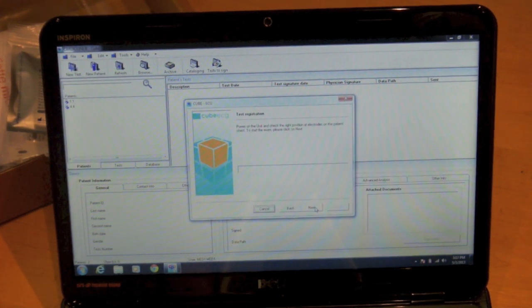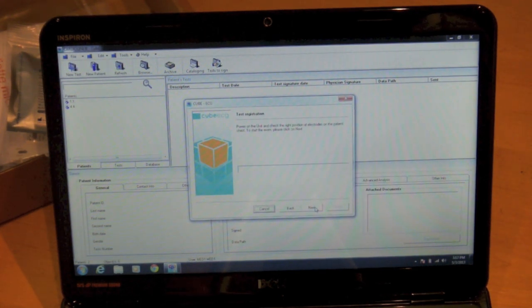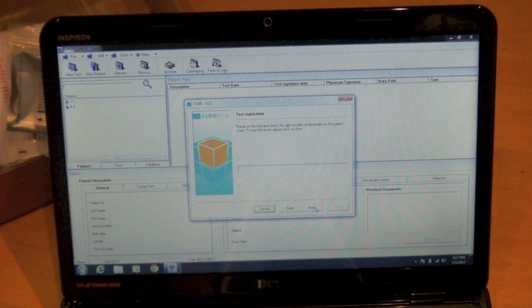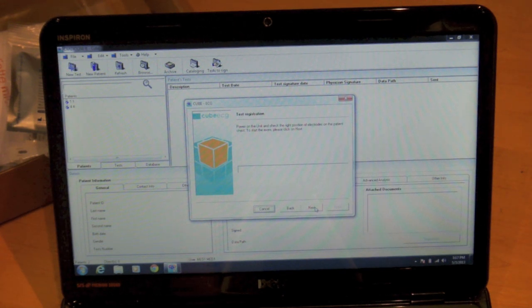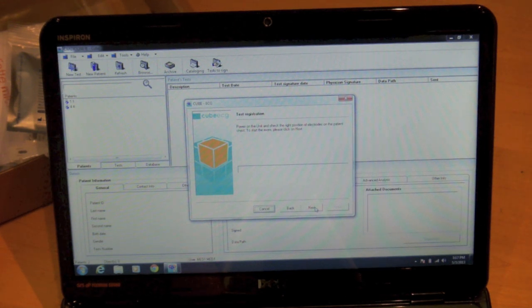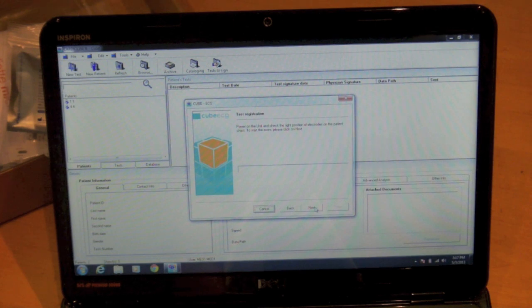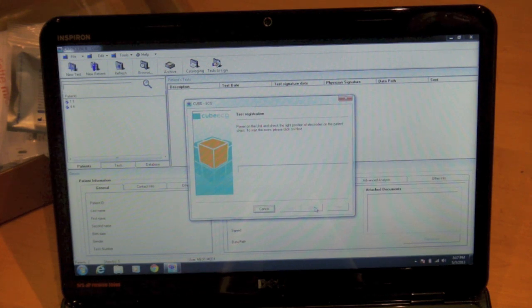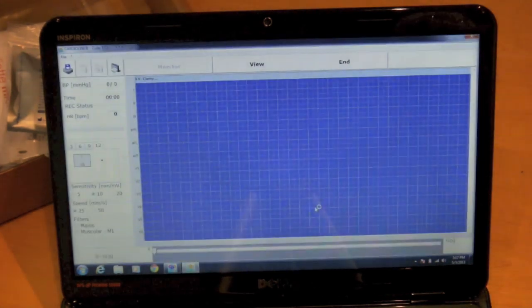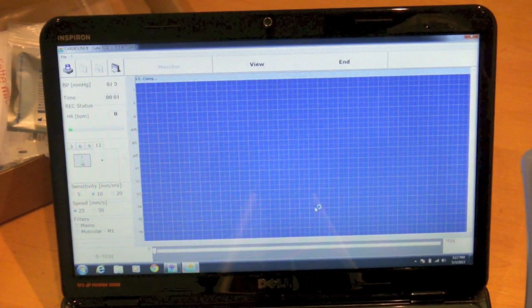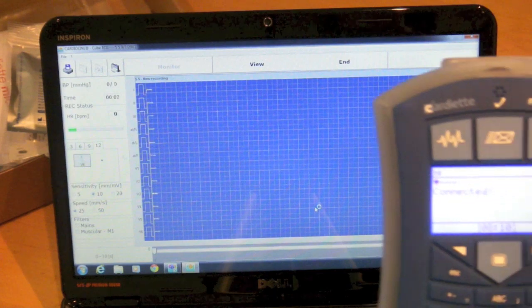It's going to ask you if you have any specific indications or medications that you want to note. And then it's going to tell me to power on the unit and check the positions of the electrodes, which in the instance of this demo we're not going to do, and hit next.